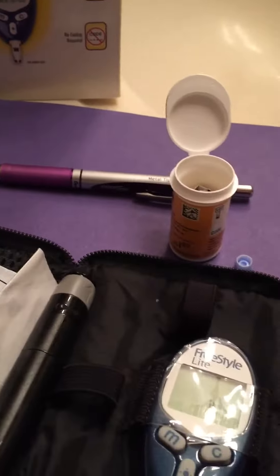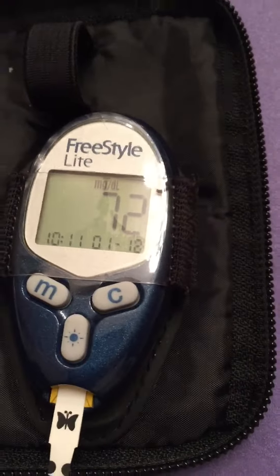It is 72. In between 65 and 120 is what my range is, and I am right on the money.